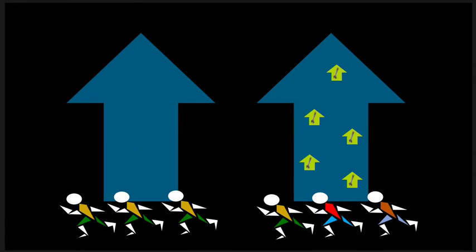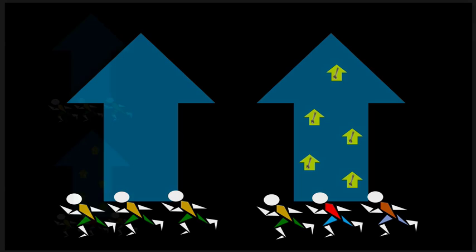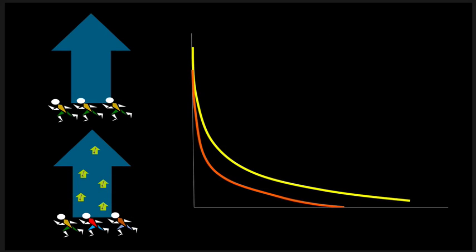Now, just as a review, remember, now we've got some heterogeneity within that local field, right? There's a little bit of speckles of susceptibility augmenting that local magnetic field. And because in this state it's still concentrated within the red blood cell, it's strong enough there to actually create a signal change.